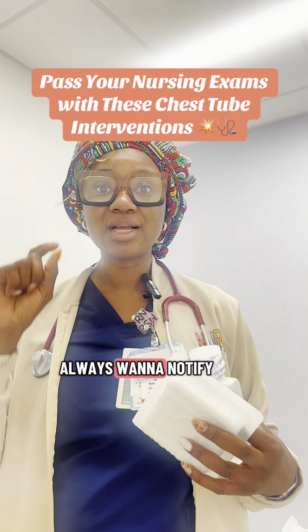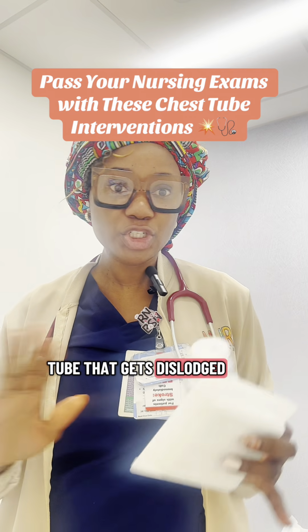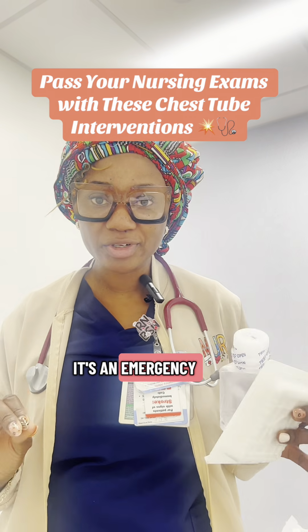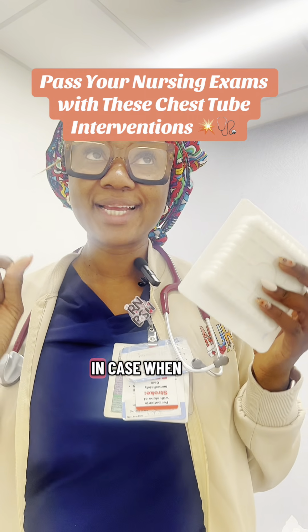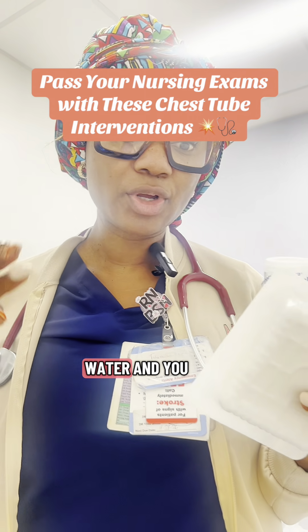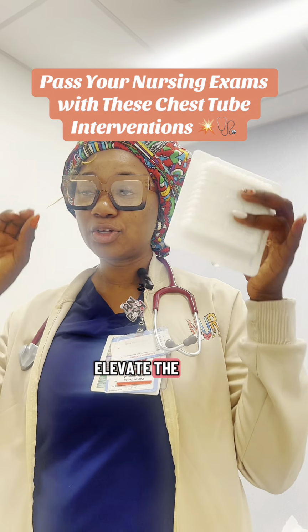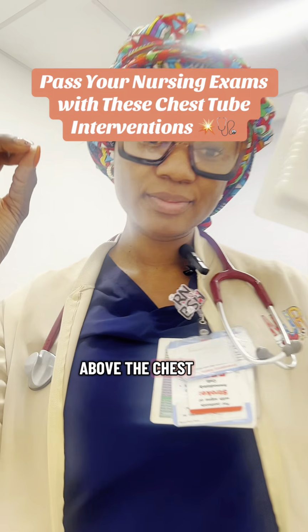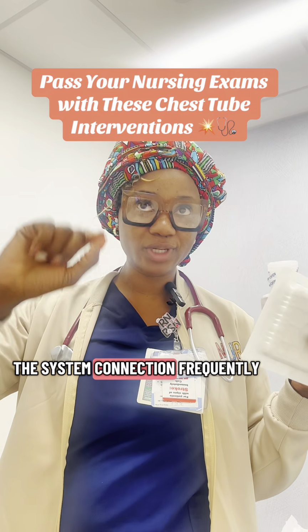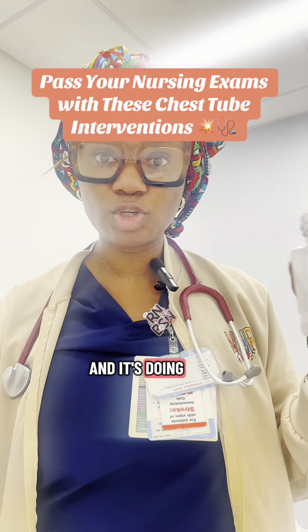You always want to notify the doctor. It's an emergency. When a chest tube gets dislodged, it's an emergency. Keep the emergency equipment at the bedside in case it gets dislodged: you want sterile water and an occlusive dressing. Okay, you never want to elevate the chest tube above the chest. You want to check the system connection frequently. It's the suction, it's connected to my patient, and it's doing what it's supposed to do.